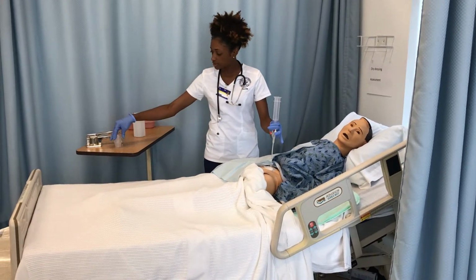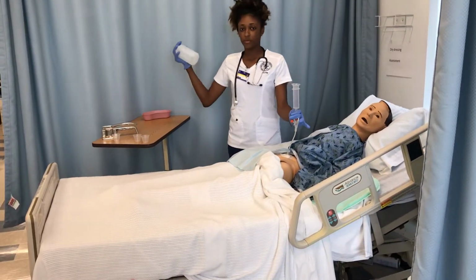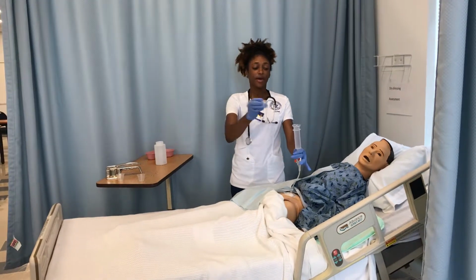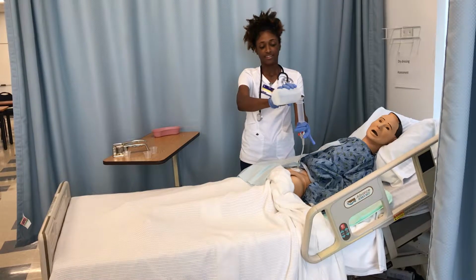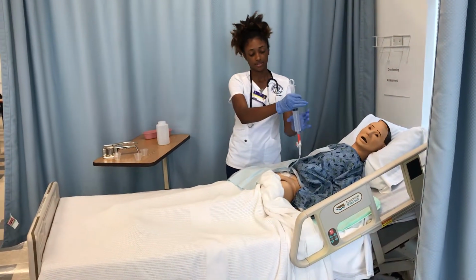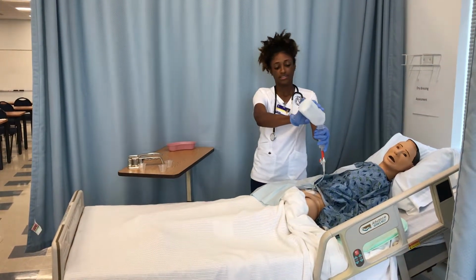Okay, so I'm gonna fill these with 30 milliliters of water each. I'm going to take my Jevity 1.5 and shake it vigorously and then administer it. Correction, I would put the 30 milliliters of water first and then administer the nutrition. If it were to become occluded, I would take the plunger, insert it into the syringe, and pull back on it, and that should correct it.